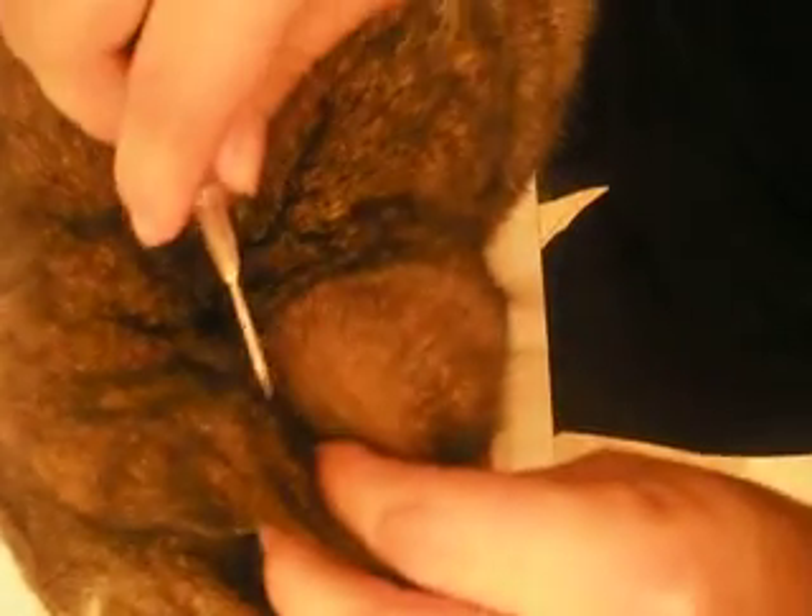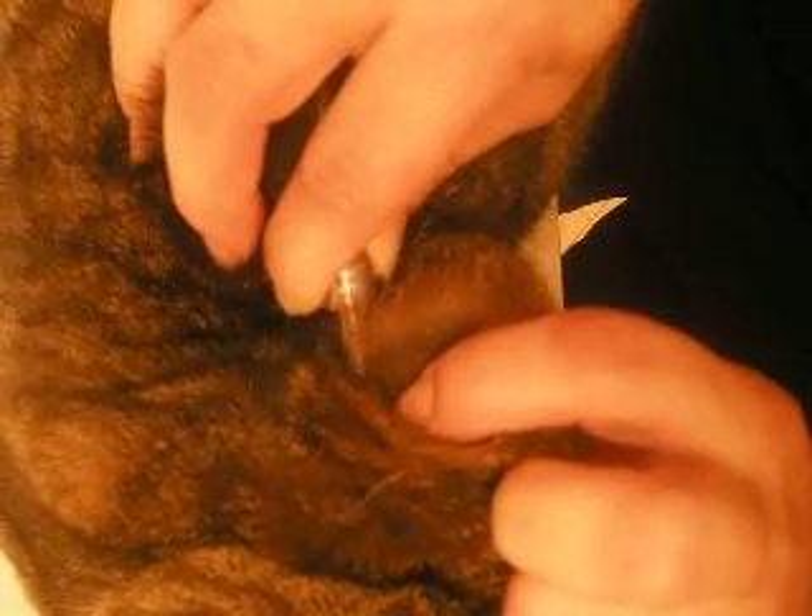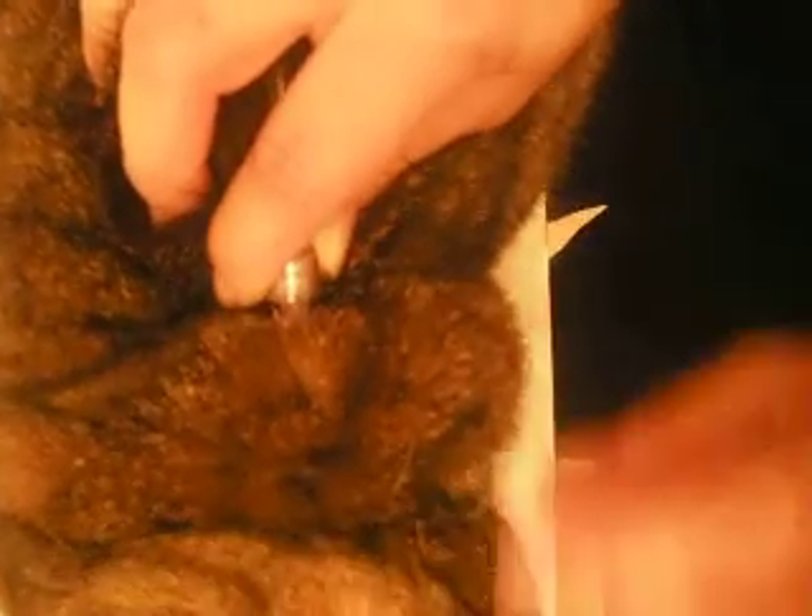Then you just lift that and insert the needle gently, parallel to the spine, like that. You don't go at any angles — you just go straight in with the needle.